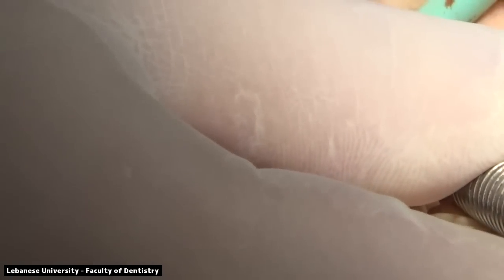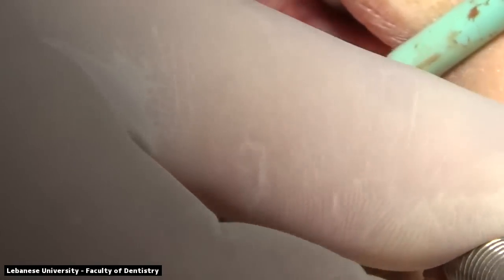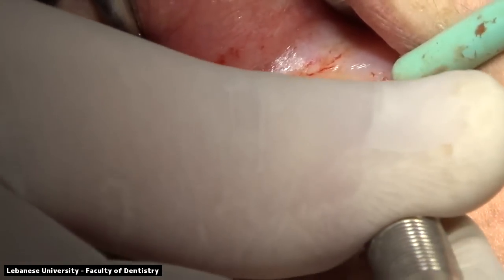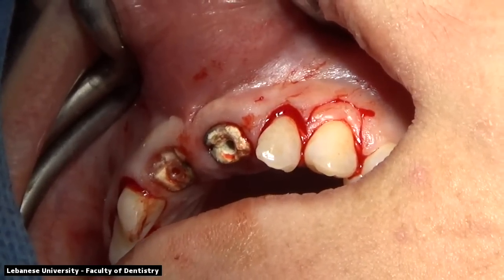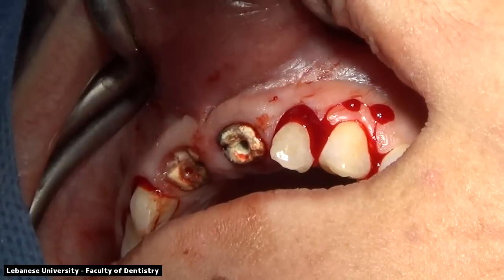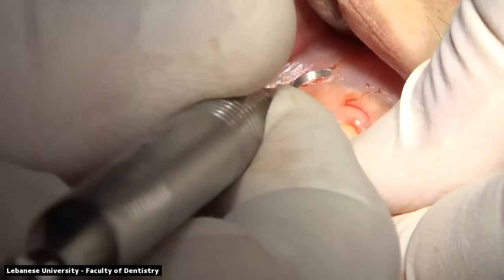So what we're doing right now is the beveled incision on the canine portion, and we're creating it exactly like the right side portion, whereby the zenith is created and the internal sulcular incision is done as well. This will be on the same level as the central incisor, 1 millimeter almost higher than the lateral incisor gingival margin. The curette will be used again to remove this excised tissue.